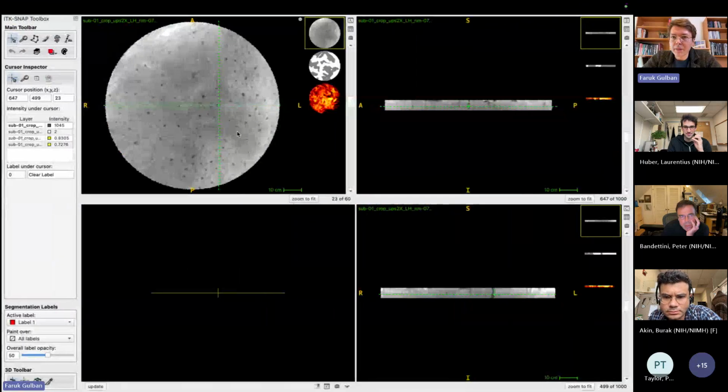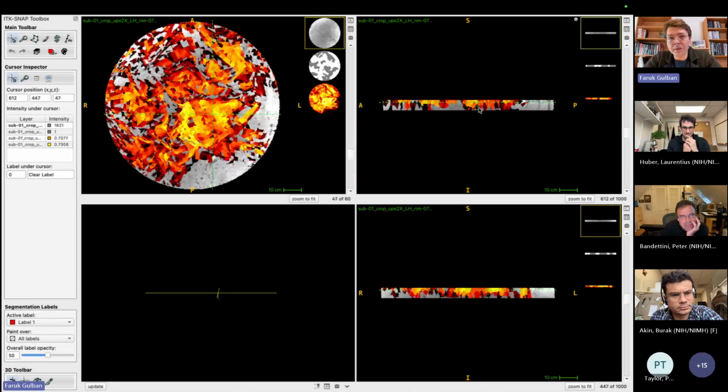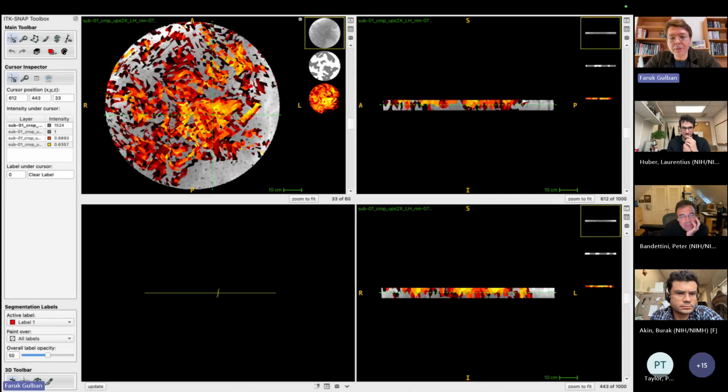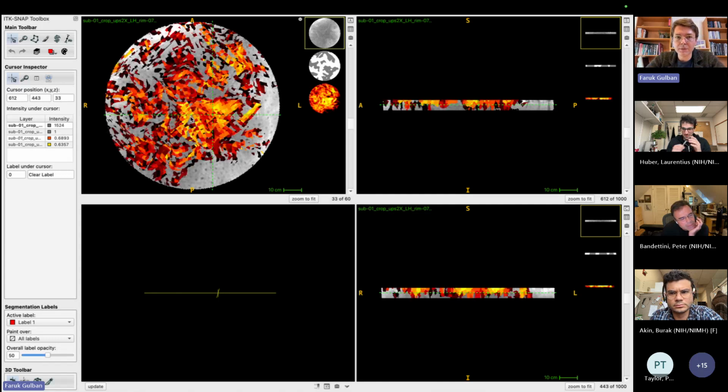Oh, by the way, also in LayNii, we can do things like this. This is a flattened piece of motor cortex, and you can see all the meso veins there, and we can overlay them with the activity. This is a 0.8 millimeter activity. I will not talk too much about it, but just to say that all these things will be coming more and more in LayNii IDA in the future. It will be one software to do all these flattening and layer analysis and activity maps and so forth.